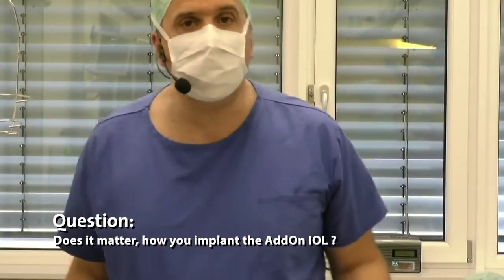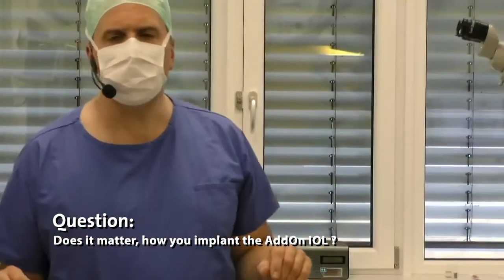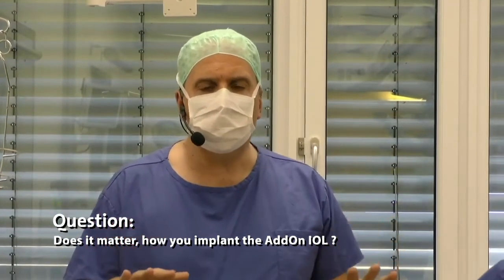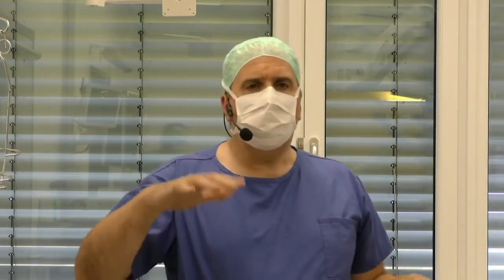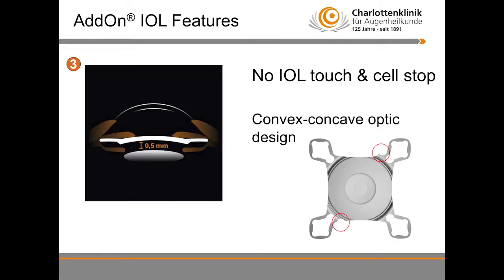Yes, it does matter. I didn't focus on that to not be too complicated. There are two little spots on the side of the add-on IOL indicating the surface and back face. So there is an A side and a B side for two reasons. First of all, you have to align the lens in the convex-concave plane so that a touch of both IOLs can totally be avoided.